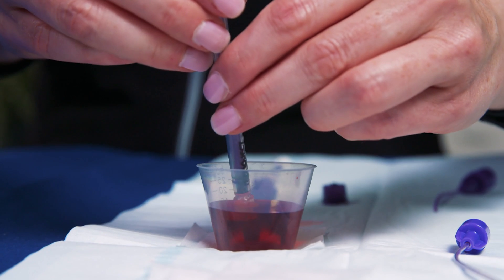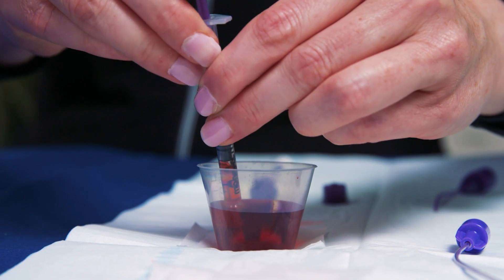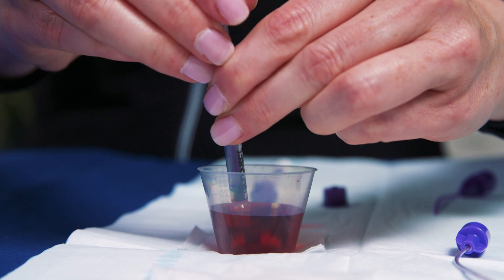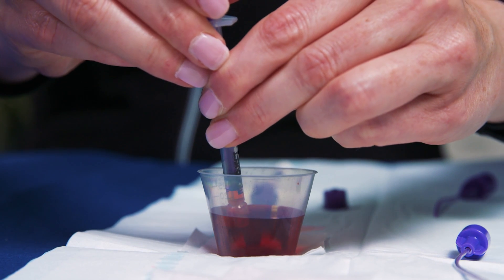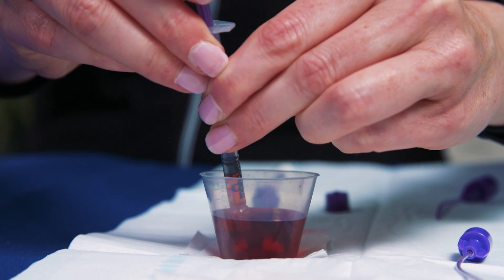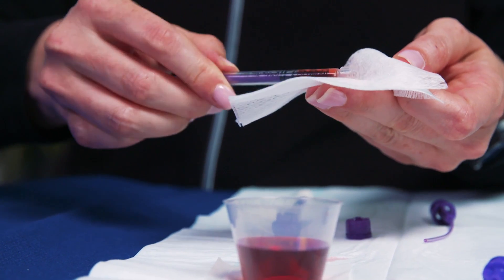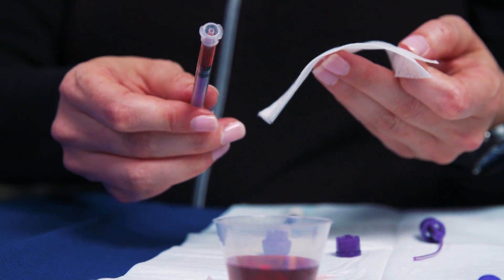First, submerge the tip of the syringe into the medication cup after priming the syringe, pulling and pushing the plunger back and forth, and gently pull up the syringe plunger to fill the syringe. Next, remove air bubbles, then flick the syringe or wipe the edge of the medication to remove excess medication in the tip.